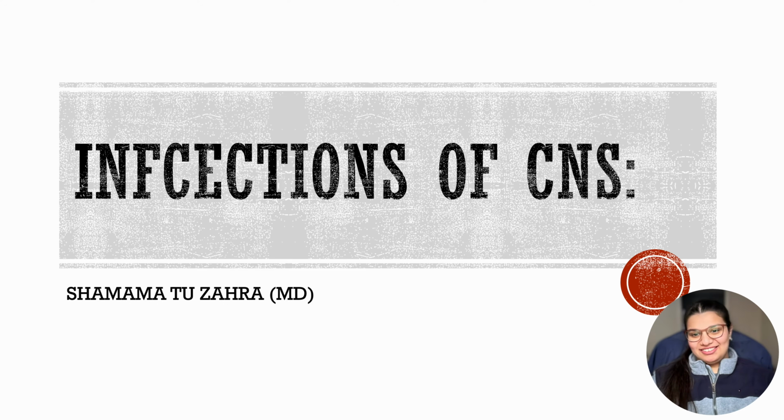This is Dr. Shamam and today our topic of discussion will be very interesting and very fascinating for pathologists to see under the microscope. So this is infections of the central nervous system.